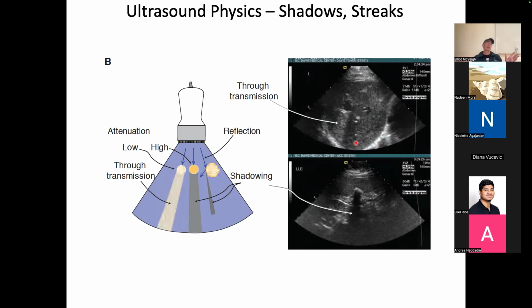They're very dynamic. So when you're holding the transducer and you're trying to find a place in the heart, these streaks are just coming and going in real time. And essentially, they learn to read through them. They just know that's an artifact. That's not an actual change in tissue that's got this correlated shape. I'm not going to call this a tumor in that shape, right? But you have to take all this into consideration when you're looking at things.